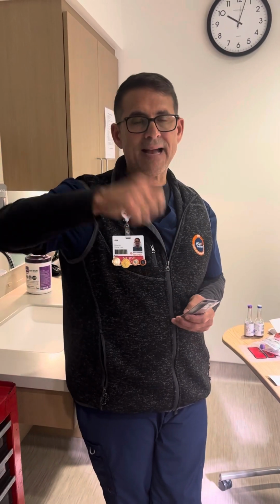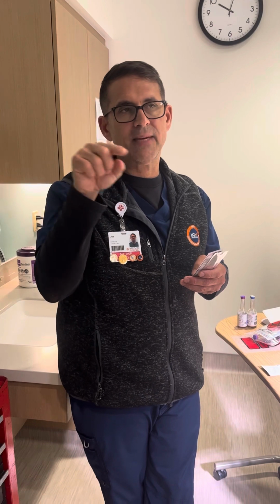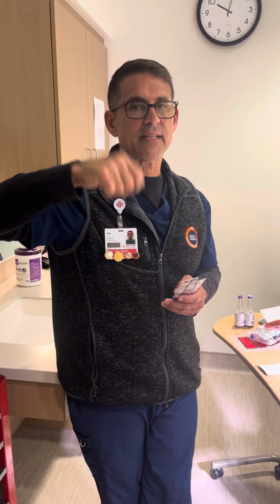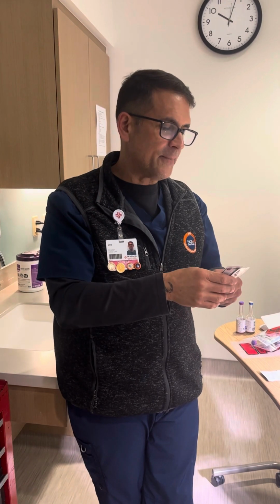So you're going to scrub back and forth the area. Don't do a gigantic big circle. Just do, like, I would say, maybe an inch or two around, up and down. Vigorously rub for 25 seconds, count it out. Don't spit on the patient while you're counting, right? Wear your mask, or just count in your head.